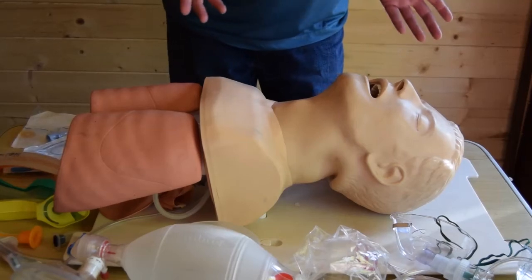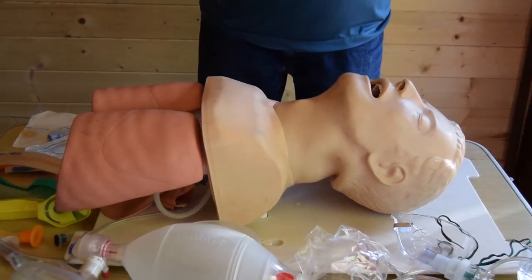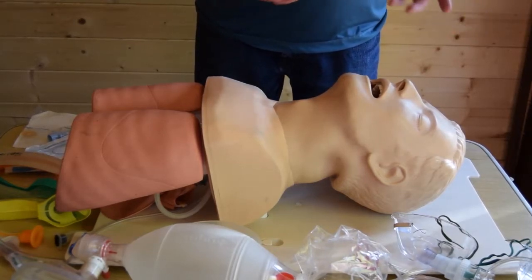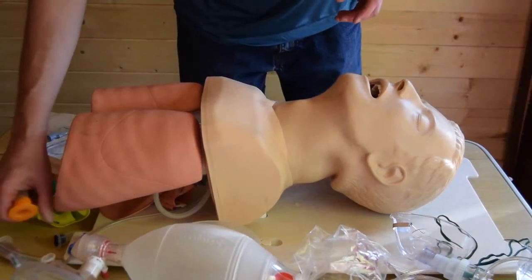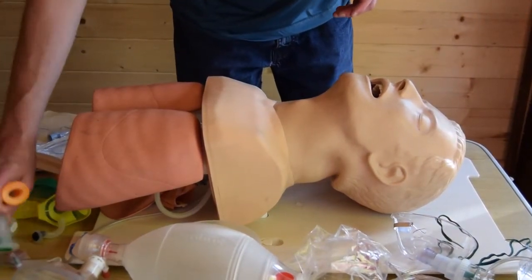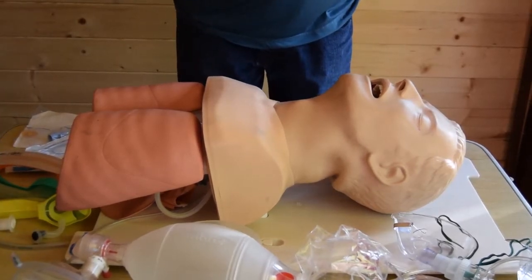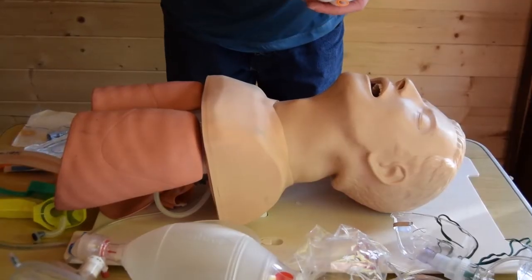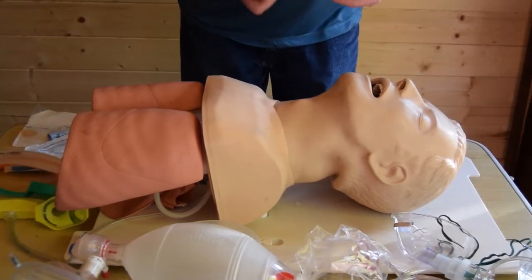we now have some additional adjuncts we can use to support the airway. Again, we can use a stepwise approach, so we use simple ones and then go on to more complicated ones. So if we have a look at some oropharyngeal airways, I have some here. They come in various sizes, as you can see, right down to children's and ones for infants as well.